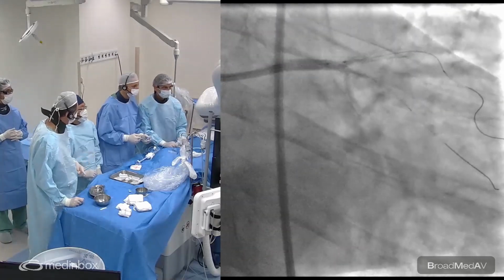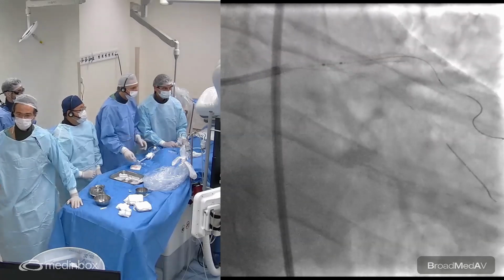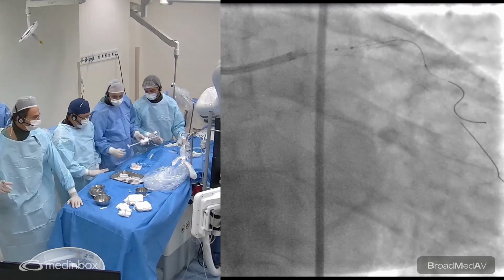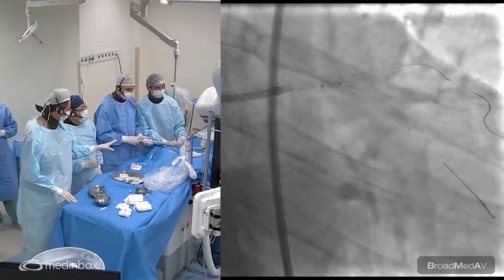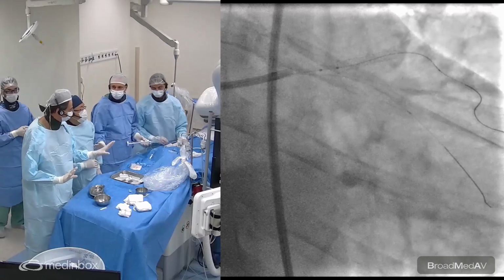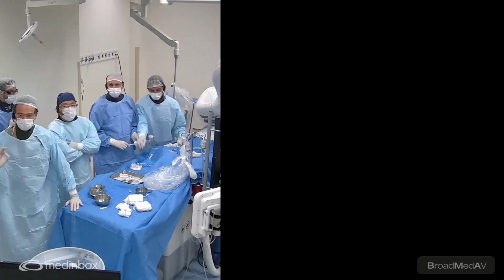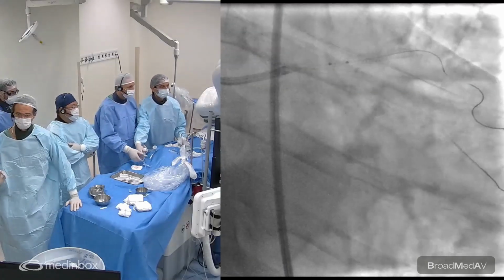You pull your guiding catheter through the left main, you can have some problem. So what Rodolphe did... Here we like this position. Back and forward. Now, can you get a zoom there? Hold on. So we have time. Let's show where you positioned the balloon. It's very important, this point.